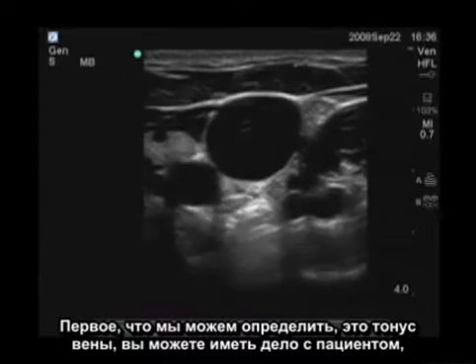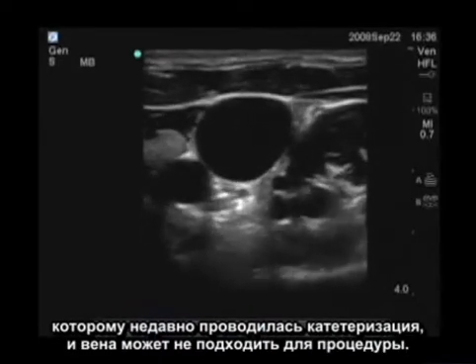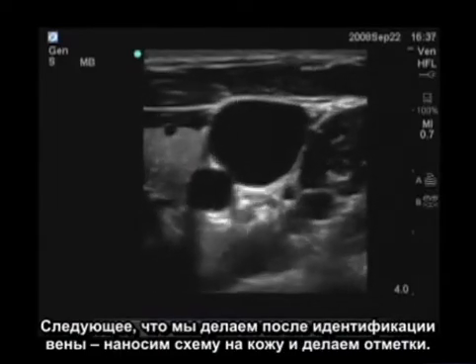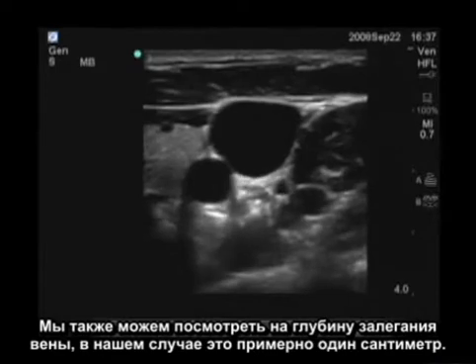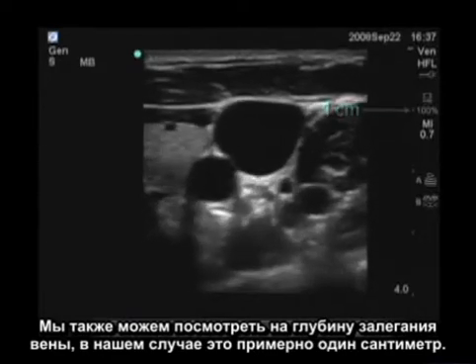The first thing we can identify is whether the vein is patent — a patient who has had a previous cannulation may have a vein that's not a good candidate. Second, once we've identified the vein, we can map the skin and put marks on it. We can also look at the side of the ultrasound image to see how deep the vein is; in this case, it's about one centimeter deep.